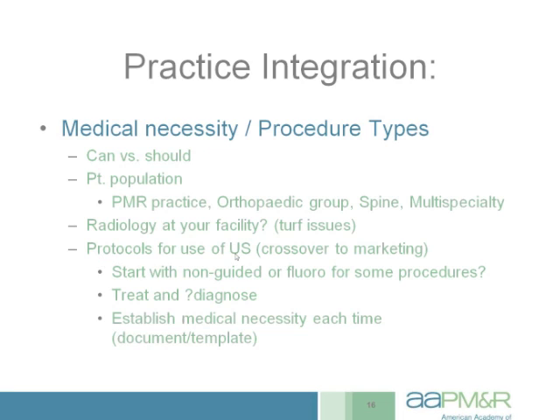Developing some kind of protocols is useful from both a practice efficiency perspective as well as a marketing perspective, so people know what you're offering and why you're offering it. In our practice, oftentimes the orthopedist will start with a non-guided procedure when appropriate. For example, if they're seeing a patient who appears to have some impingement syndrome, they may offer them a non-guided subacromial injection. If they're confident in their diagnosis but the patient doesn't respond appropriately, particularly if they had a high BMI or other anatomic factors that make them wonder if the procedure was accurate or successful, they then might send them to me for an ultrasound-guided procedure of that same area.